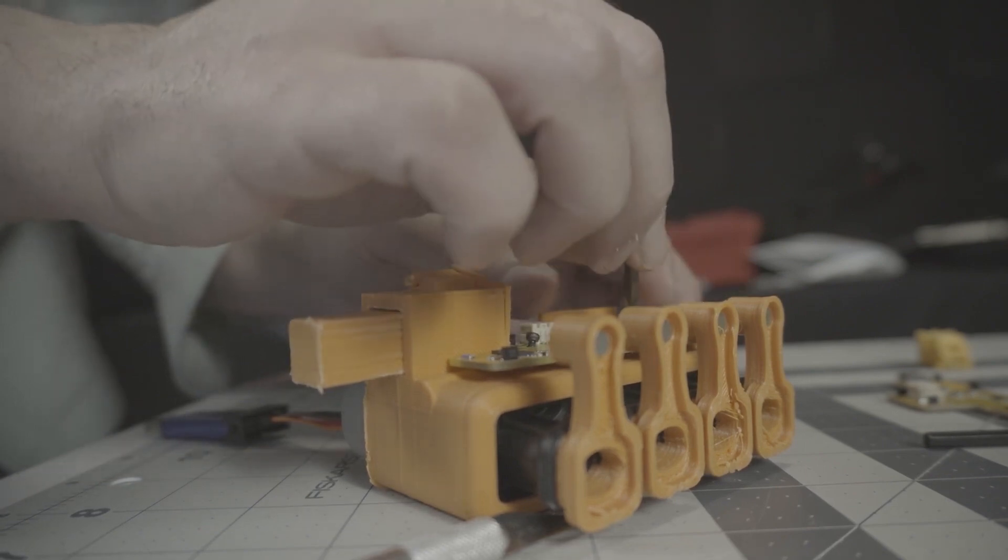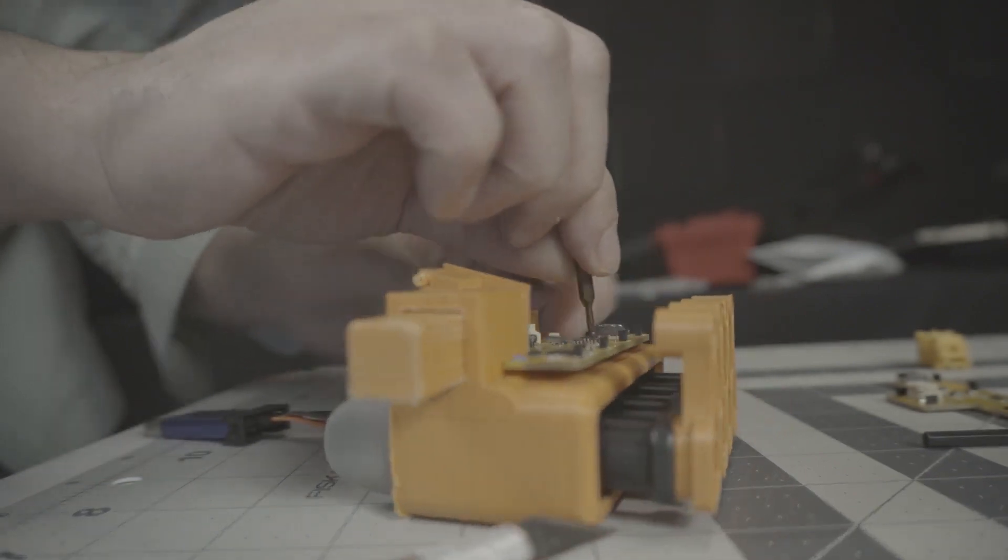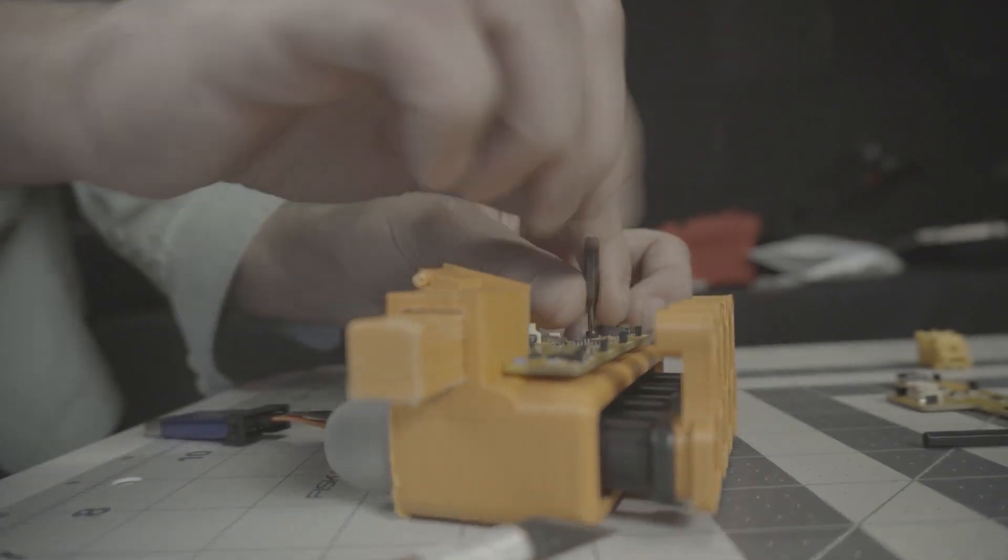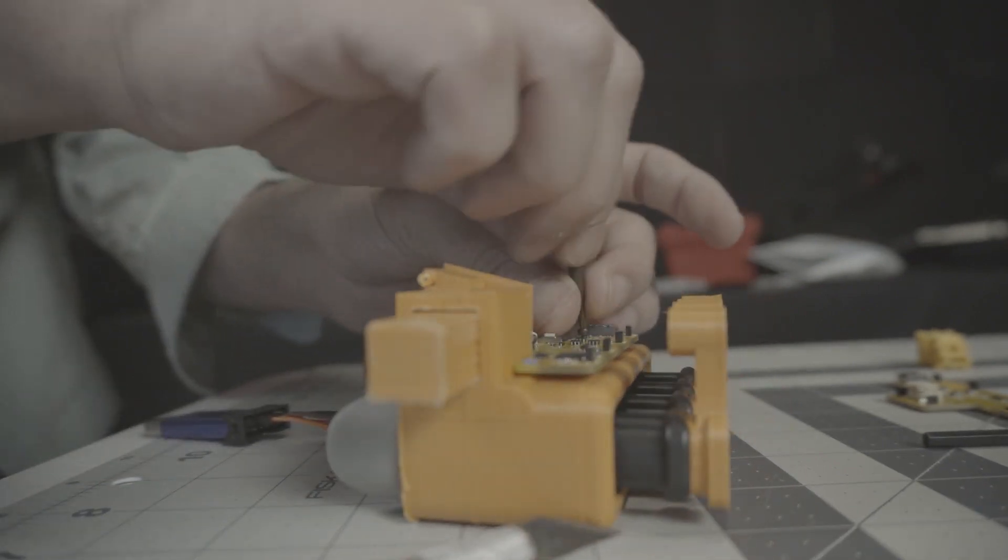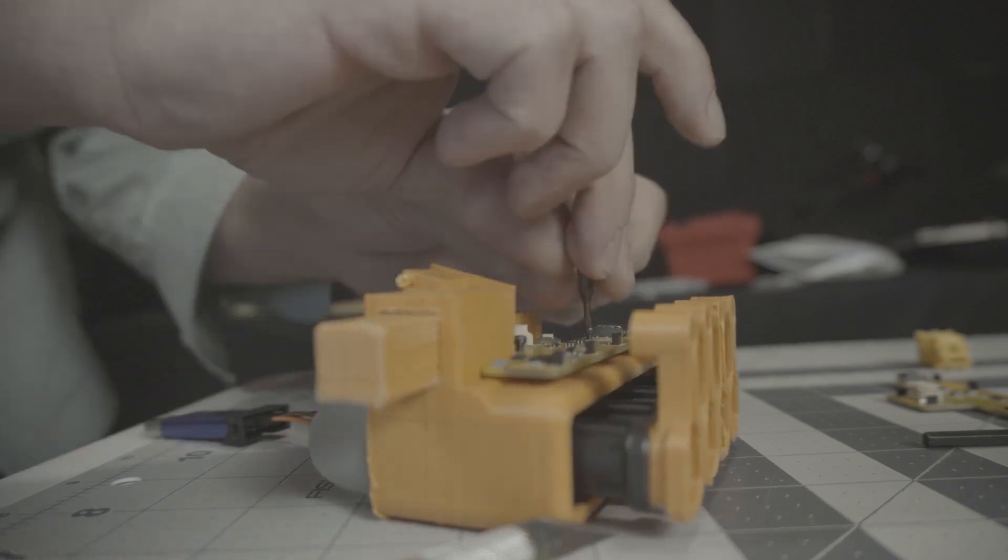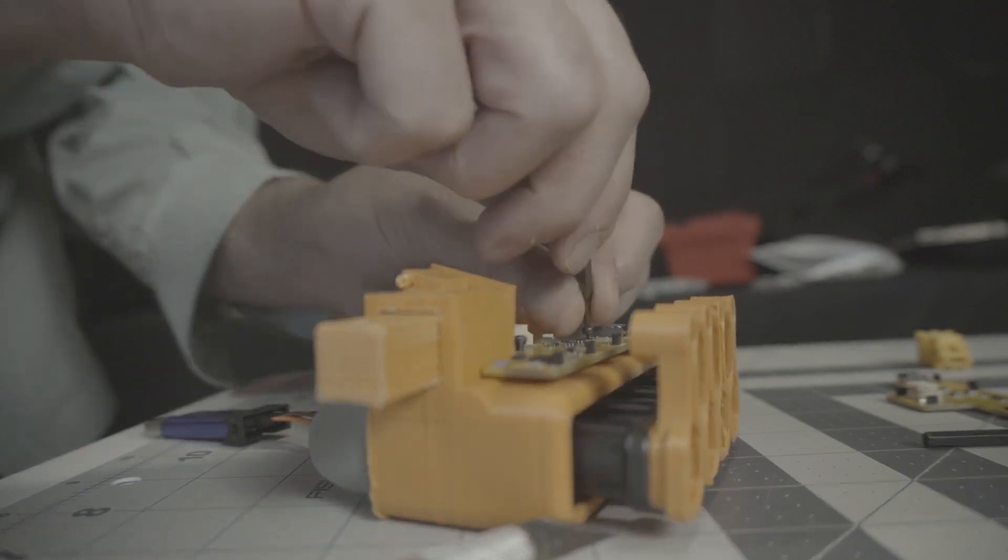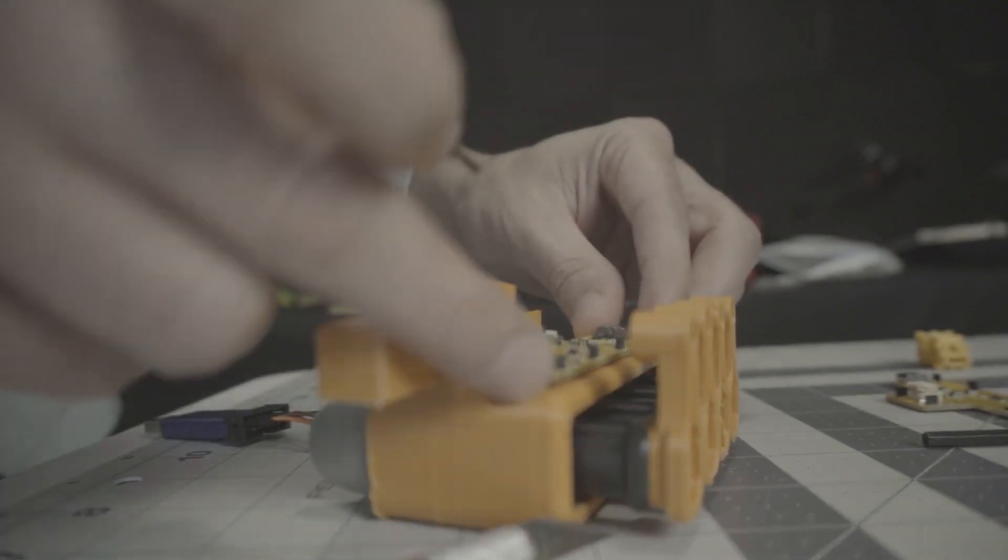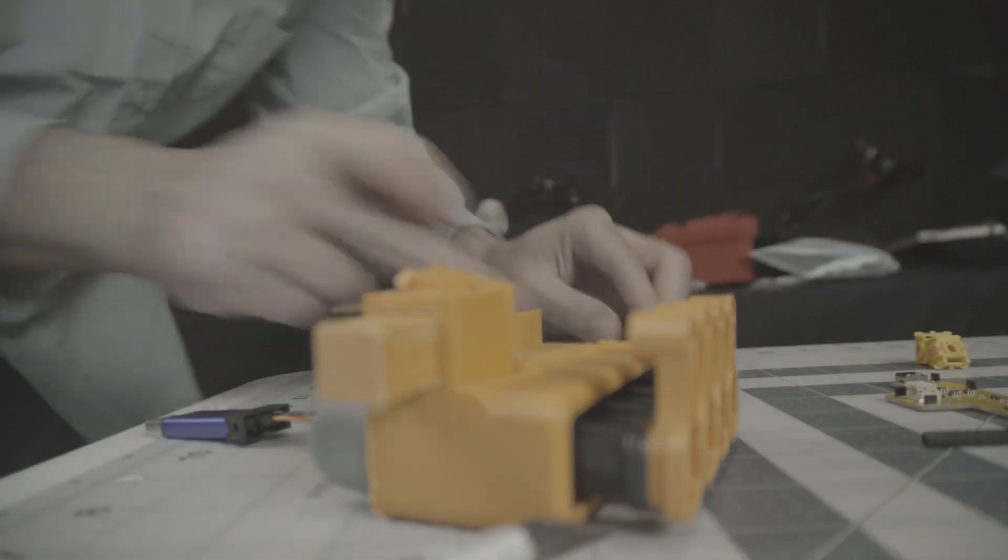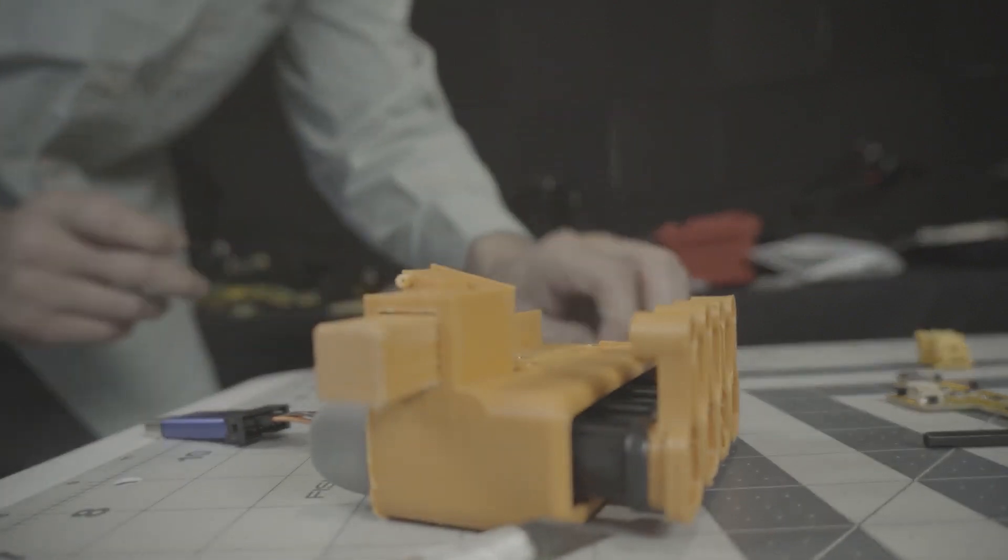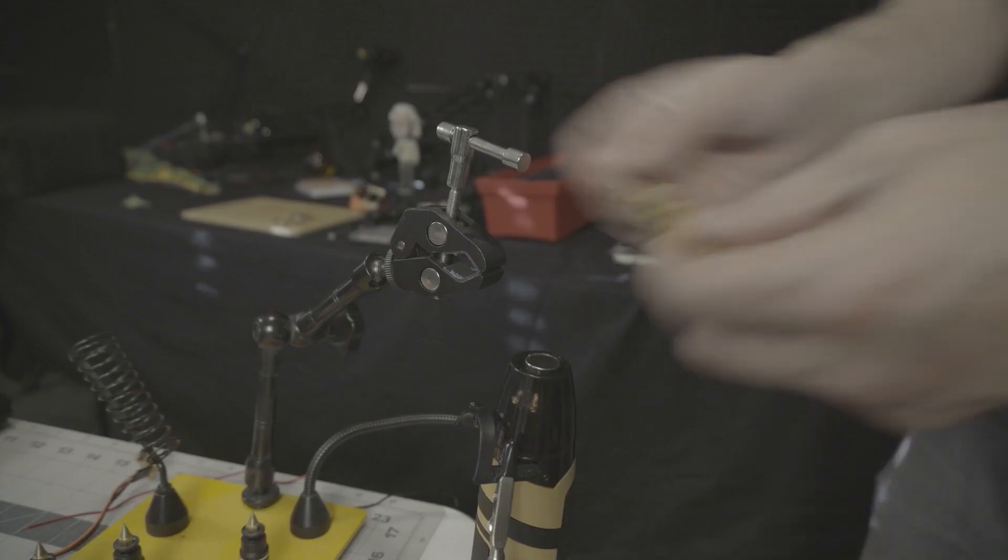When we sent this file to PCBWay they asked us if we had the polarity right or the orientation for the hall effect sensor correct, and it turns out that we didn't even though I said that we had it correct. So we're gonna have to correct that here today.